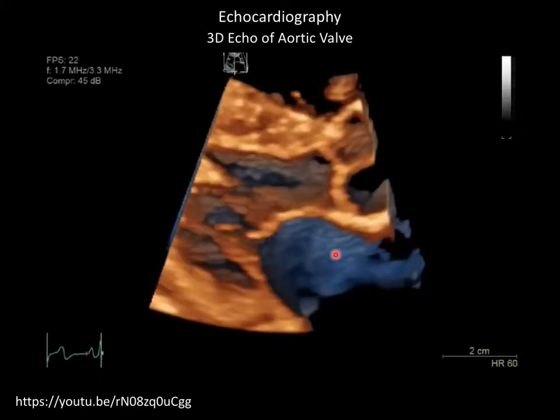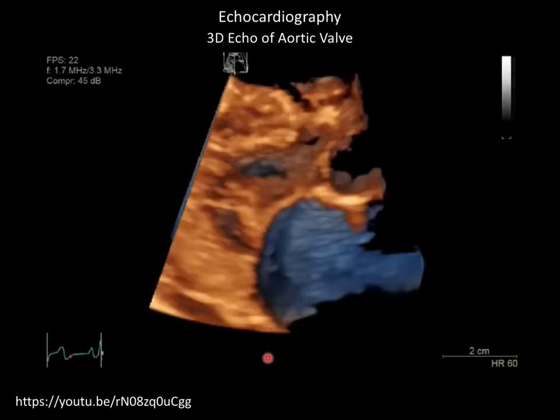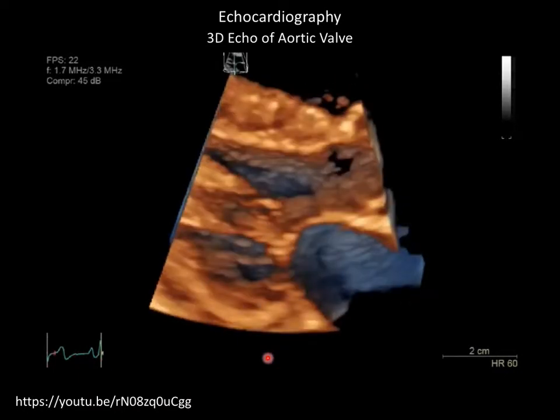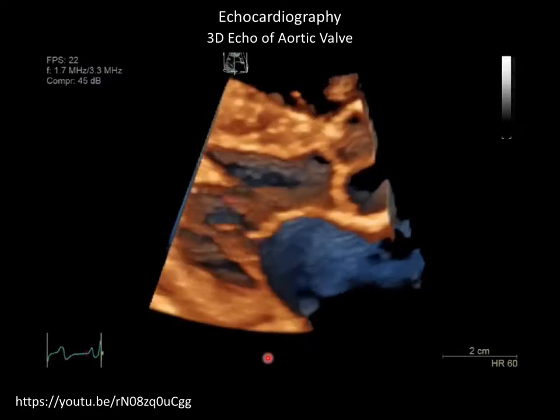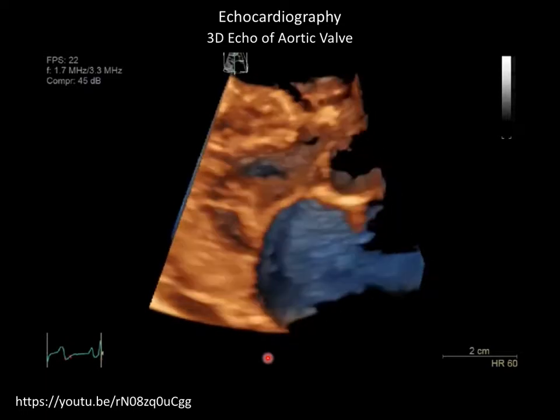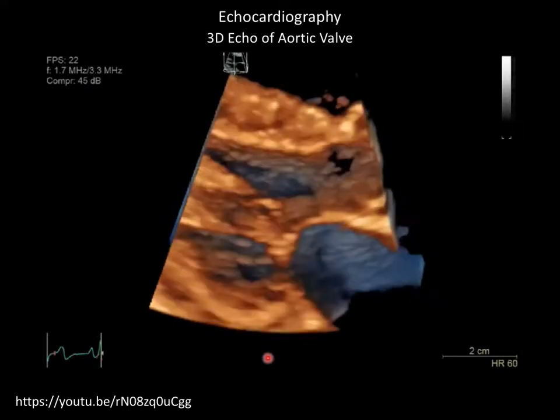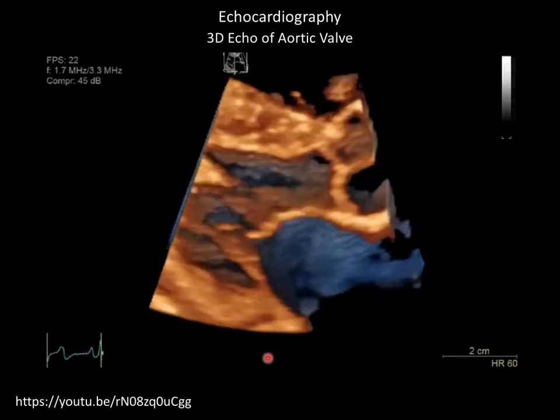This is rendered in 3D because the data was obtained in 3D. And so you can think of this as a set of 2D images. So you make a 2D image, and then the transducer automatically changes the angle of that 2D image to a section of tissue that is next, and then the next slice, and it just sweeps back and forth. So it's like you have a fan, and you're rocking the fan back and forth this way to make a 3D volume.